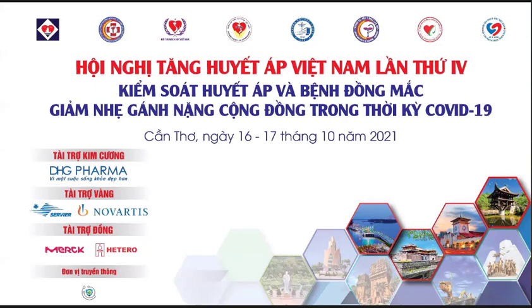Okay, so in that case you use the implantation of pacemaker only for prevention of cardiac complication in case of diphtheria. It's more clear. Yeah. The reason why we do the procedure is to prevent the hemodynamics from becoming more compromised and the disease more severe.